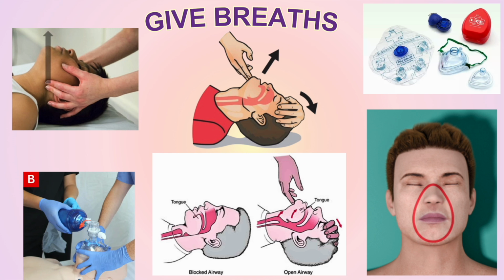Now let's talk about barrier devices. When giving breaths during CPR, standard precaution is to use a barrier device. Examples are pocket masks, which are preferred, and face shields. You can see both in this image. Rescuers should replace face shields with a pocket mask at the first opportunity.